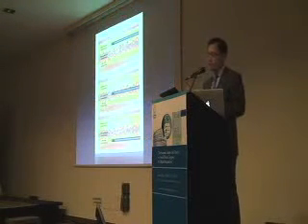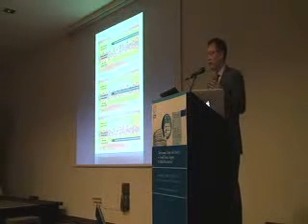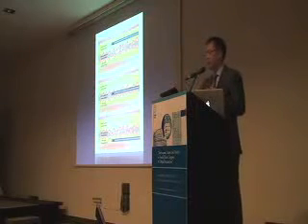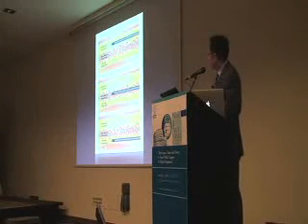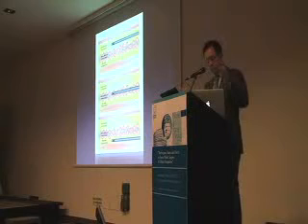And then the conceptual thing from the textbook is, when people ask me what plane you're in, it's a feeling plane, and I'm going to walk you through verbally with photographic sequences what plane, and then I'm going to show you with video so that you have a double reinforcement. But essentially, most times it's just a plane of least resistance, okay? I'm sorry, which is just in here, and then there's a deep plane. If you think of it that way, it's much easier. And when do I do what? Let me show you.